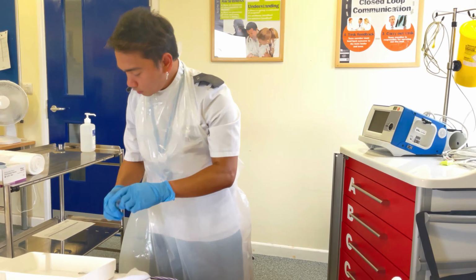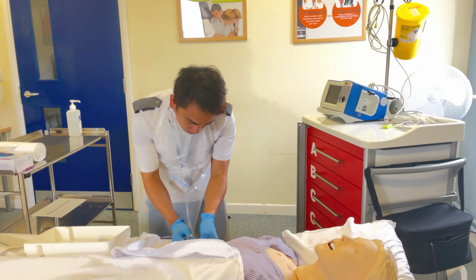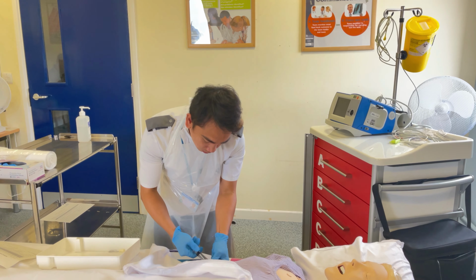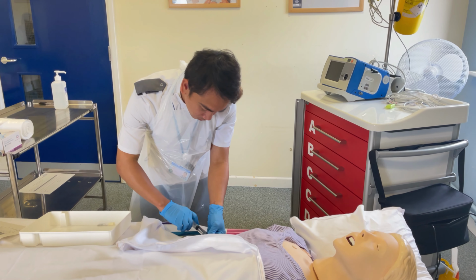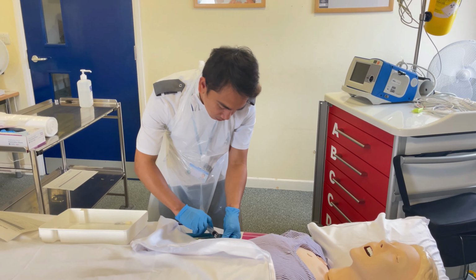So, I'll be flushing now. Your site, I'll be flushing with the saline flush. I'll be flushing it in a pulsating manner, and let me know also if you feel any pain. Okay. Do you feel any pain? No. Okay, that's great. I'm just going to finish this.